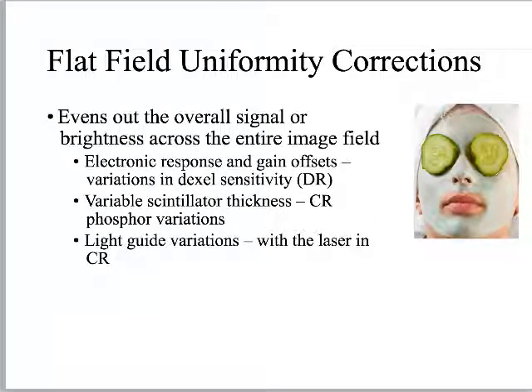The same thing could be happening with our X-rays, where there's some place where there's too much darkness, it's too dense, and it's popping the system, right? So we need to turn down the gain. It does not need to be that dark, right? And the computer knows how to do that.